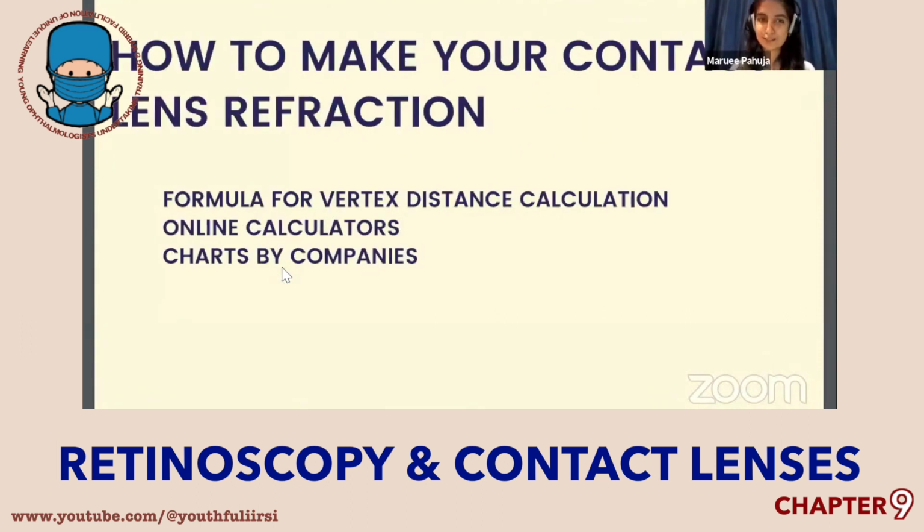How to make your contact lens refraction. I think this is the most important slide in the entire presentation. It's easy to go online and just put in the number, okay, this is my spectacle refraction, and this is my contact lens. What is going to be my contact lens refraction? So starting with that, it's easy to put it online. Then second, there will be charts given by companies. You can really decide after seeing the chart that, okay, this is the contact lens, this is the spectacle prescription. And based on that, this is the vertex distance correction that I need to do.